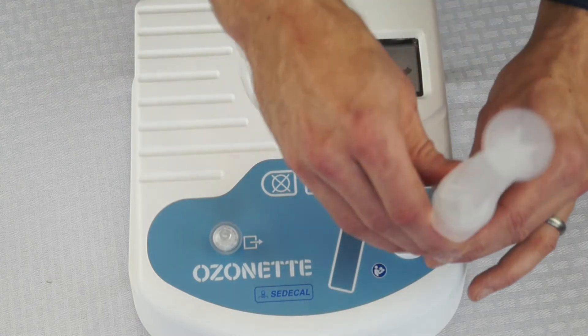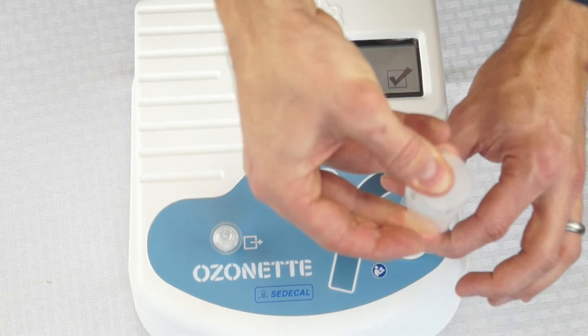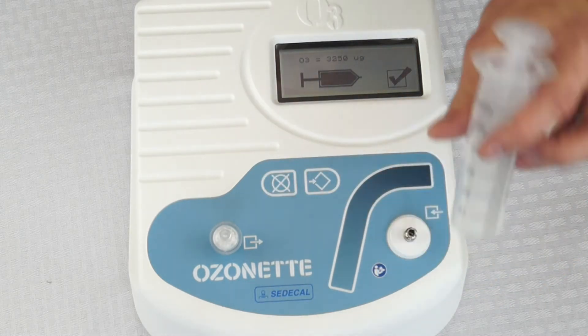When you want to neutralize excess ozone, connect it to the destruct port and simply depress the plunger and it's gone.